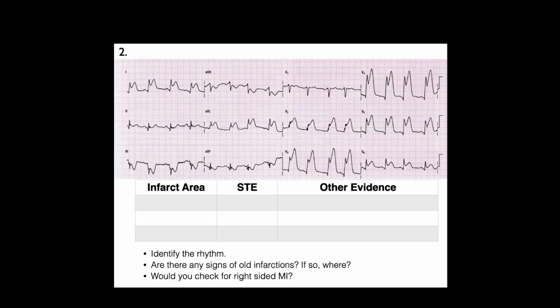Okay, so Kyle, do you want to do the next one? And I'll drop those down if that's helpful. Although here, gosh, we don't need lines. Okay.